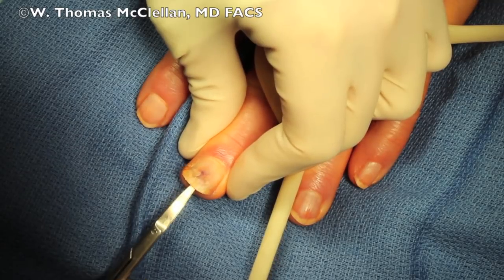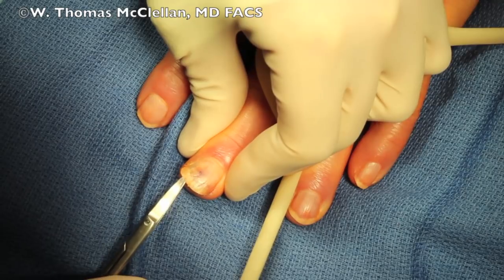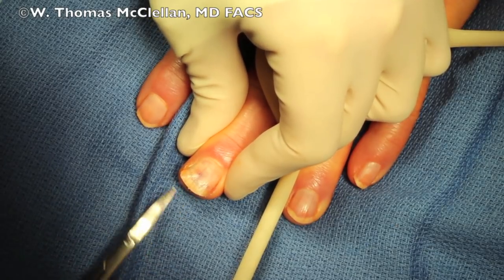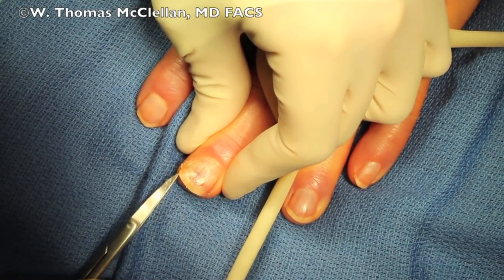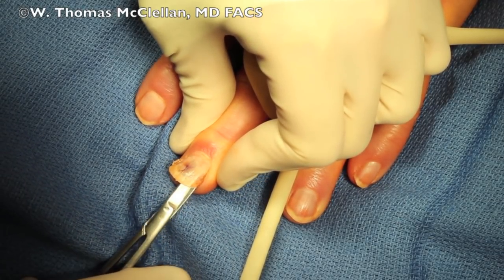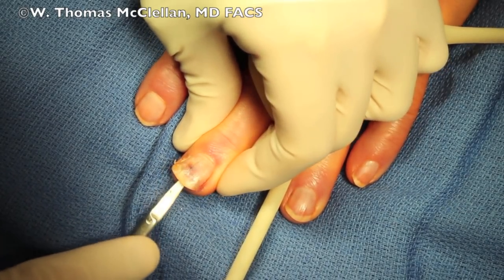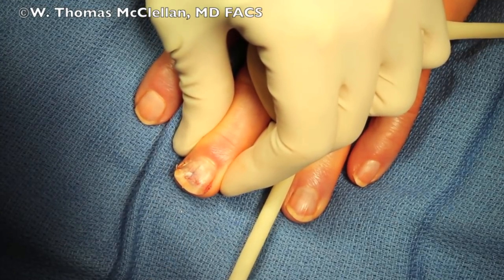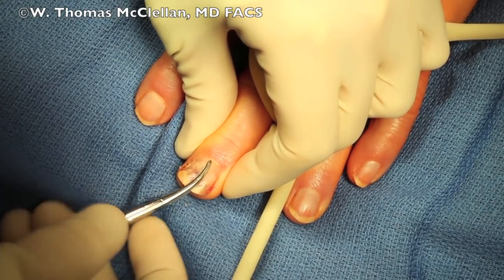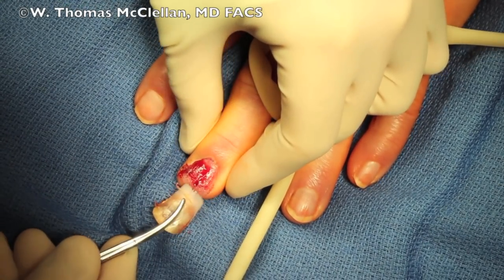And just by gently spreading, I work my way toward the sides of the nail or the peronychium, and you can see my scissors sliding up under the eponychium. Here I just do a little push on the peronychium on either side to free up the nail. Once I've freed it up, I grab a hemostat and I get a grip all the way up to the cuticle and, in a slow pull, pull the remainder of the nail off.